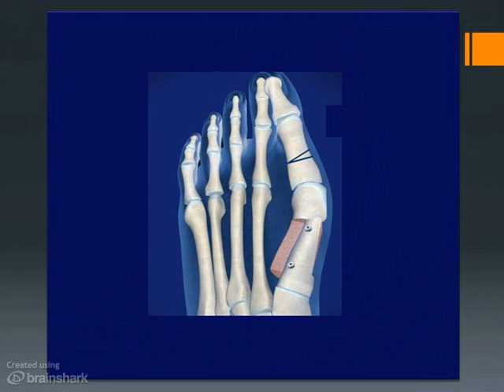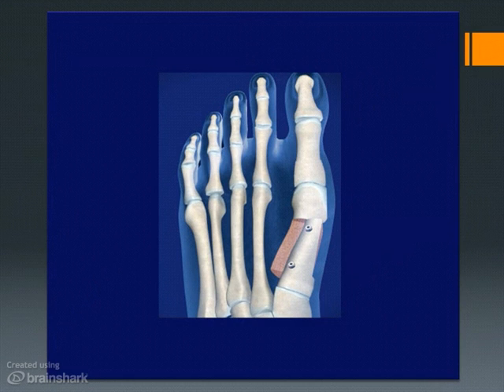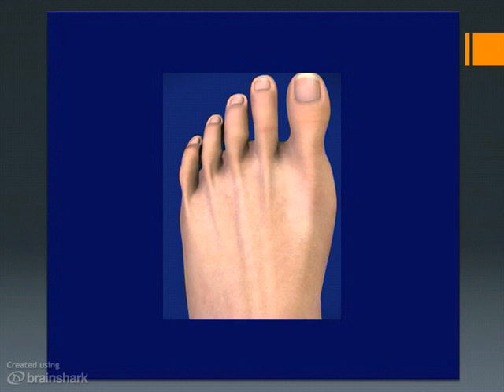We then remove a small wedge of bone from the proximal phalanx, and this allows us to realign the big toe. The bone here is also fixed with a small metal staple, and this restores a perfect alignment of the big toe and also reduces the width of the forefoot.